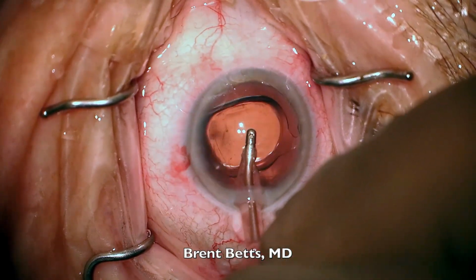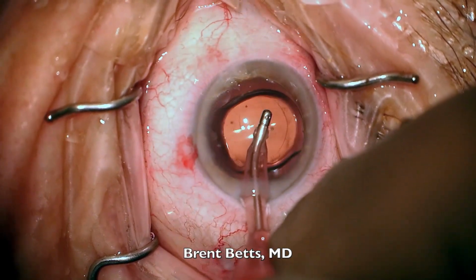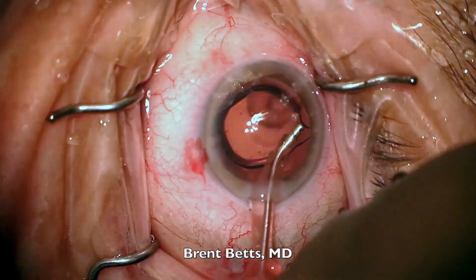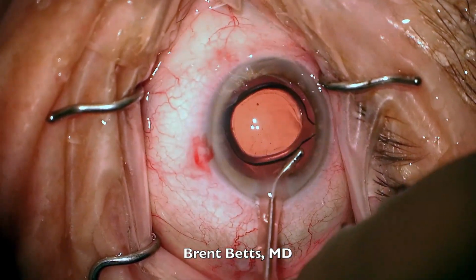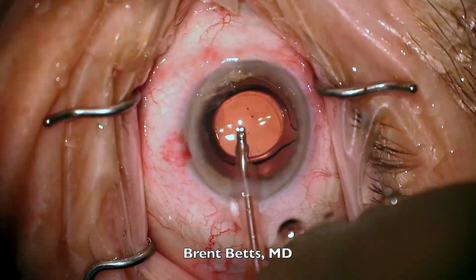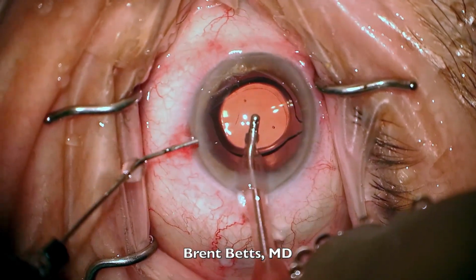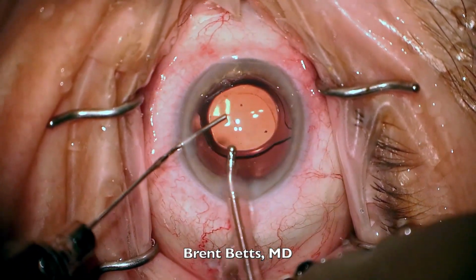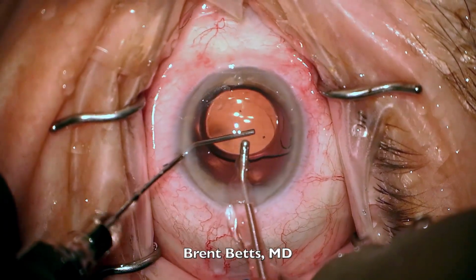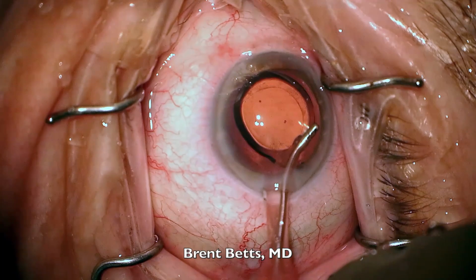Residual viscoelastic material is removed with the IA device. If viscoelastic is left in the eye, it will cause an intraocular pressure elevation for about a week after surgery. We try to minimize that by removing as much as possible. I like to use a cannula to change the flow of fluid in the eye to see if there are any small cataract pieces that are left behind.